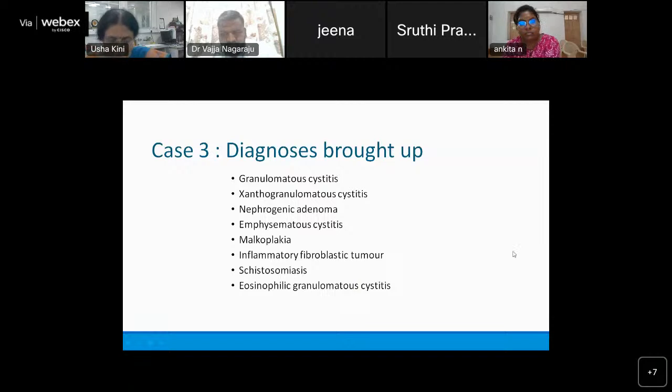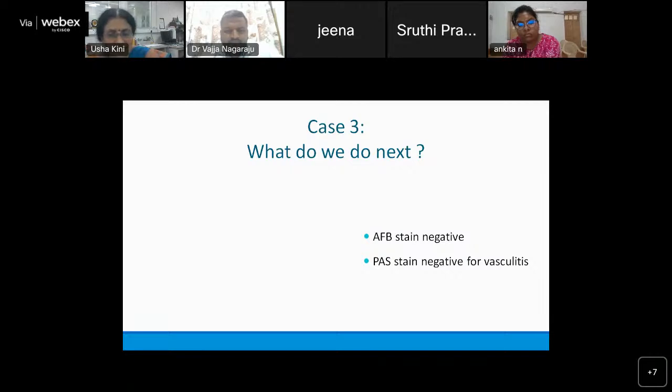Eosinophilic granulomatous. Yes, there were eosinophils, but these are all very descriptive. But do we have a specific cause for this? Someone thought of an angiomyolipoma, which I don't think it is, because we didn't have any of those elements. So what do we do next? ZN needs to be done. Yes, it was negative. PAS also. Yes, it ruled out vasculitis, which I always think of, sometimes when not, your eye should go for blood vessels, because that's one which you need to exclude in all your biopsies, even though the clinical scenario may not be given to you.